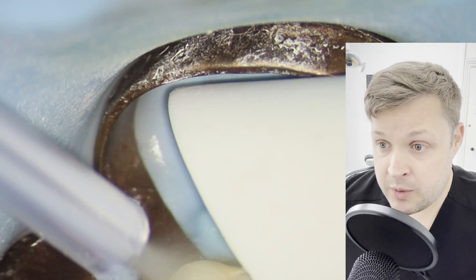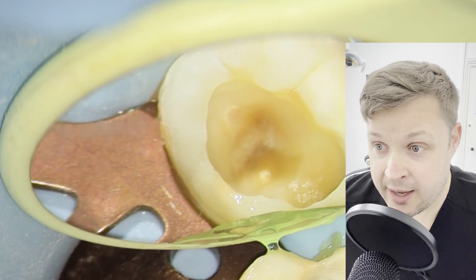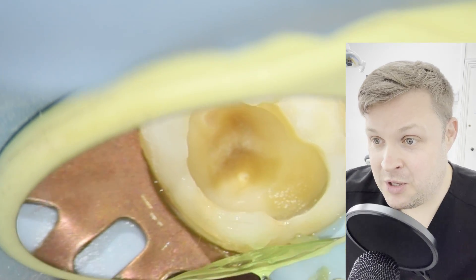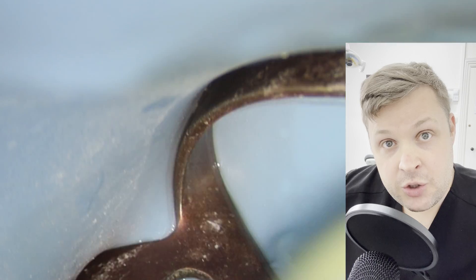Before I do the pulp cap, I like to etch first. I'm being super careful with the etch because sometimes using it can expose the nerve. The great thing about the etch is it really cleans up the whole cavity and it looks really nice.